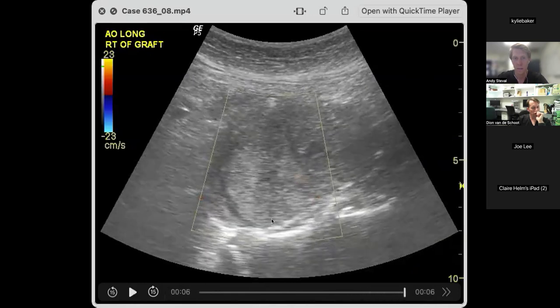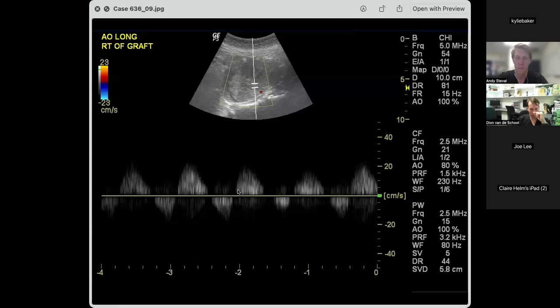Yeah, and I think that's a different area of color than what we were seeing before, and it's not a great image because the machine was struggling a little bit. It's quite an old machine, that. But again, to me, that looks like it's probably a trace of a real vascular flow. It doesn't look just like movement artifact, flash artifact, or something like that. Okay.